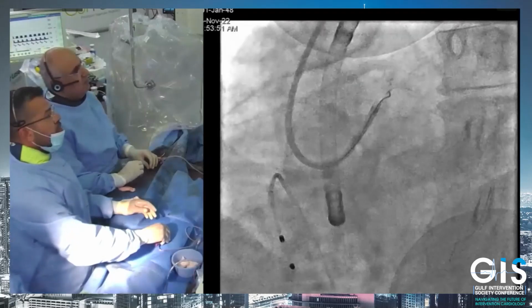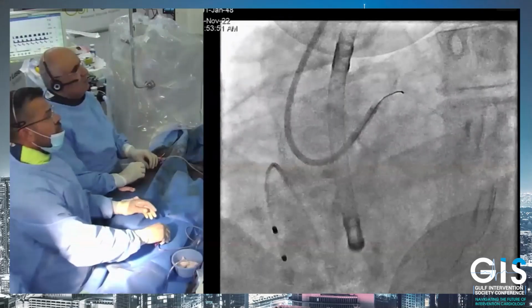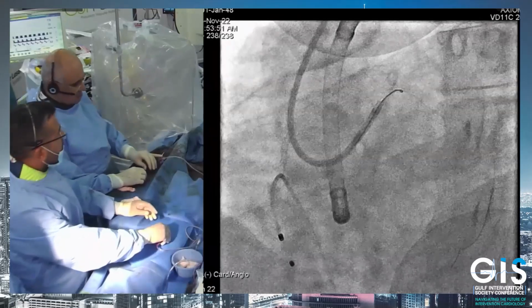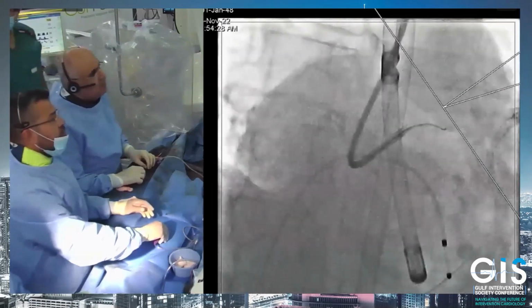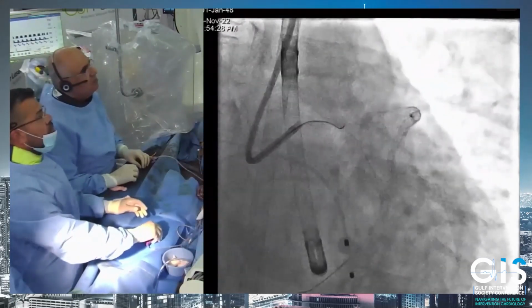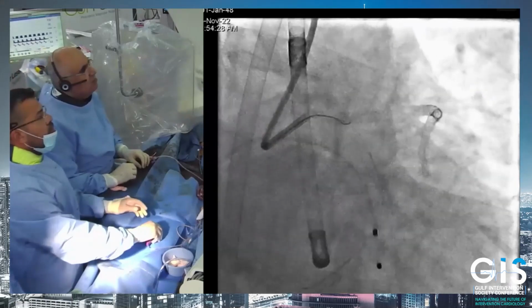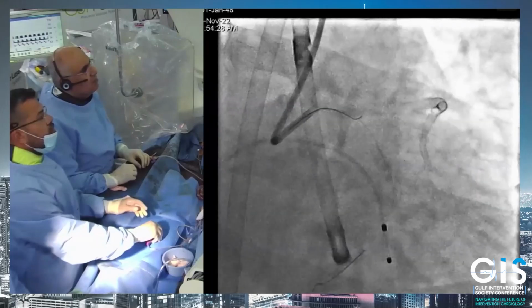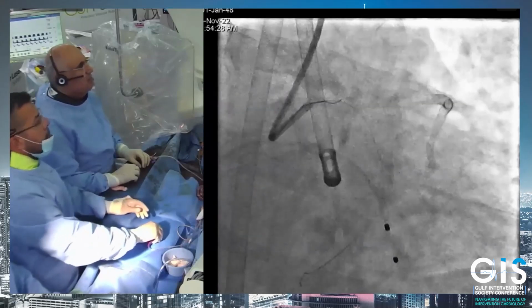Then fixing the circ first could be the right choice, because the most complex lesion seems to be the lesion that involves the LAD. Having treated the circ before could help you to go on with the LAD treatment, and especially if you have to treat a left main. I mean, because the lesion of the LAD is very close to the left main.